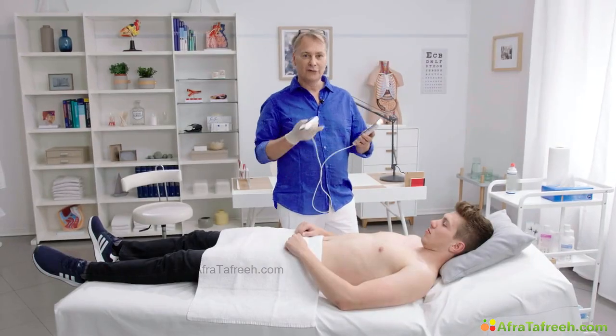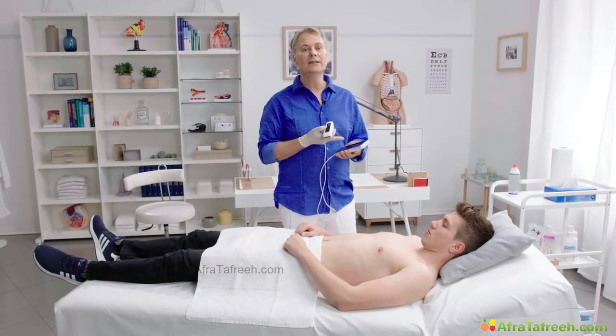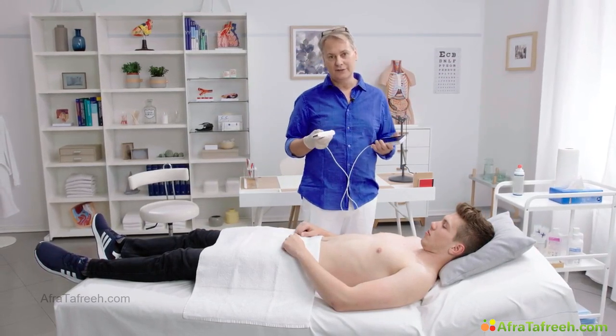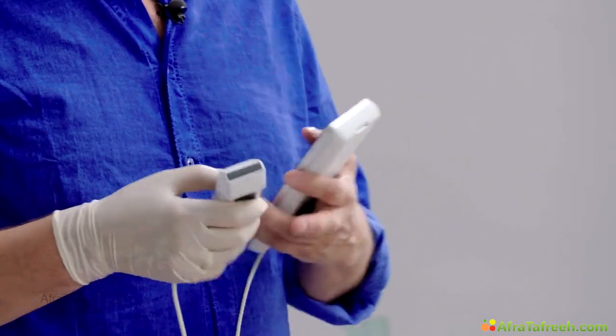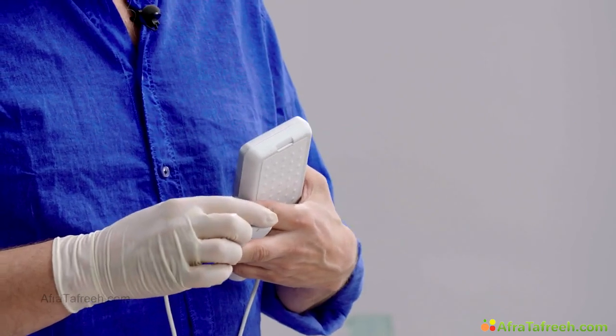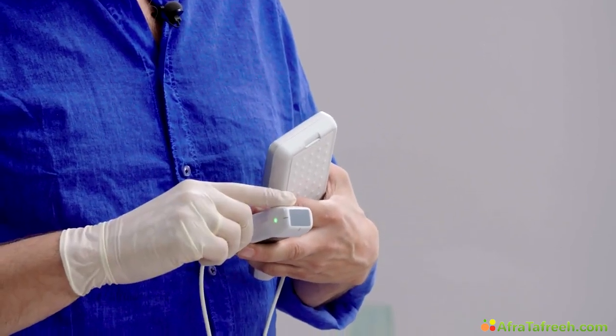Before you start imaging, the first thing you have to adjust is the setting. We need the cardiac program. Now, this specific device has two transducers in one. One is the linear probe, and the other one is the phased array probe. We'll be using the phased array probe.